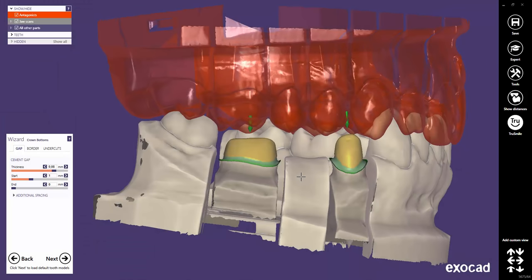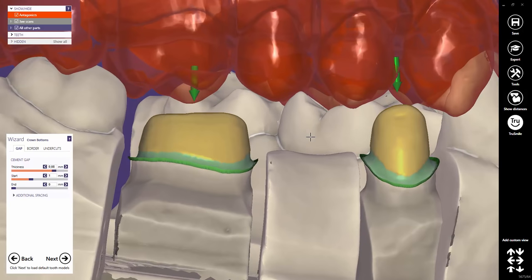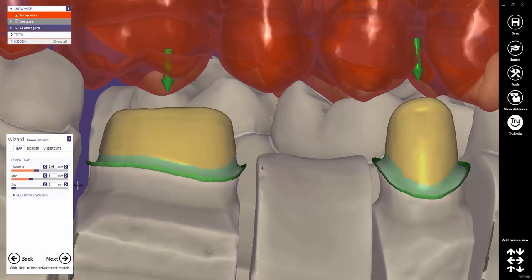In the wizard mode, all parameters defined in the wizard window will be applied to all teeth. This is also the case if, for instance, you adjust the cement gap thickness. As you might see now, the cement gap thickness has been decreased for both teeth at the same time.